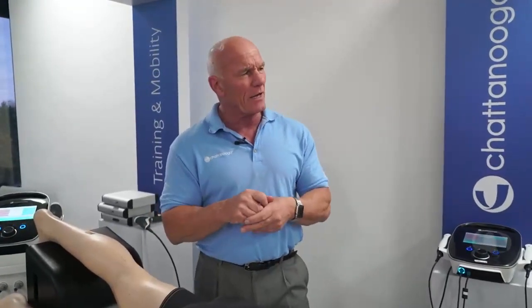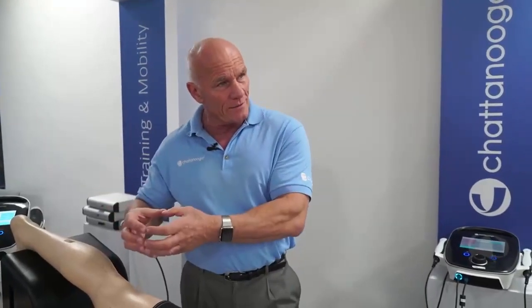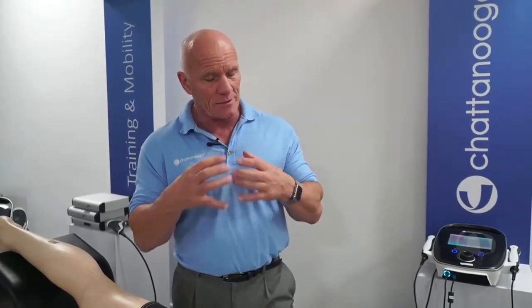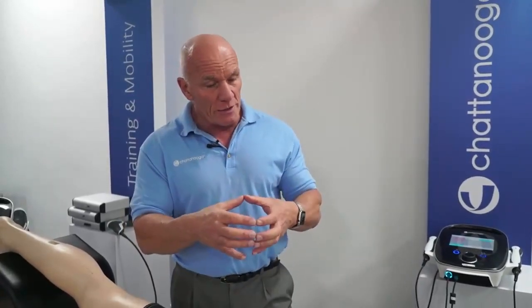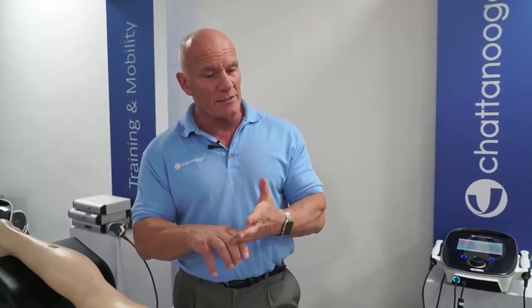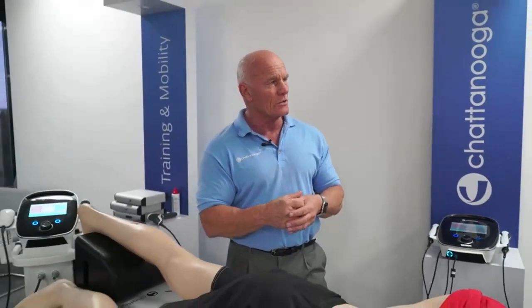In the pain research on this, they show that we can get an analgesic effect within 2 to 5 minutes of treatment, lasting 2 to 4 weeks. So that's great. That gives me, as a therapist, a window of opportunity to address the issue sort of pain-free. So now I can do my exercise, my manual therapy, my movement control, all the things that I want to do where pain may have been a prohibitor before.